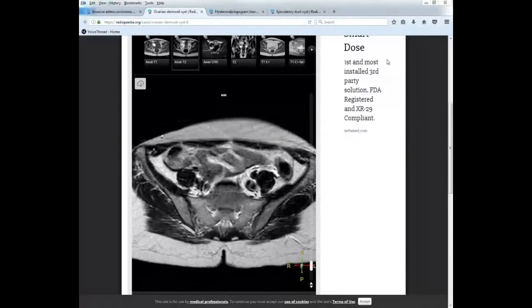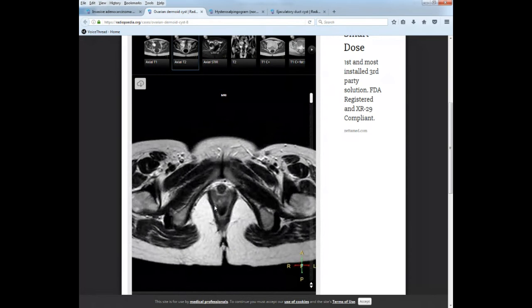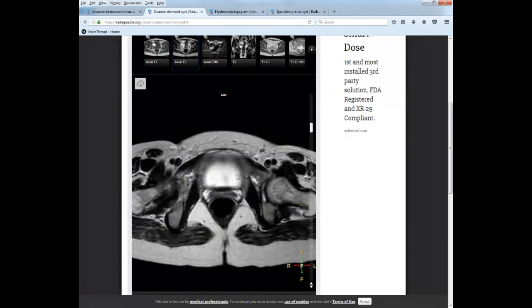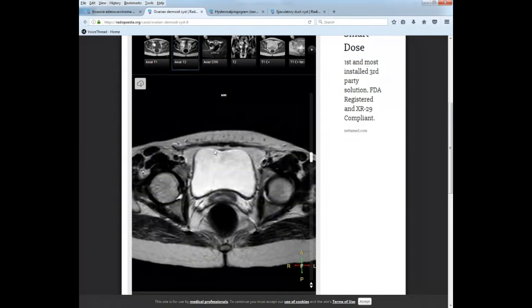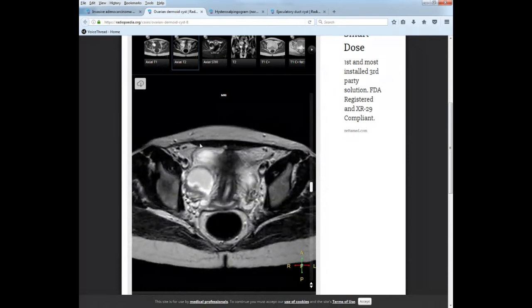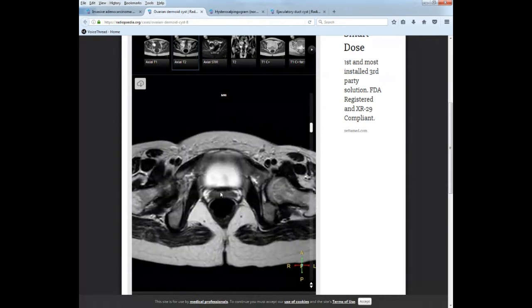We'll talk now about the female reproductive anatomy, and I'll go over some other anatomy that we haven't touched on, specifically the pelvic viscera. So real quickly, bladder. In most patients, it's going to pop right out at you. This is a pretty good sized bladder filled with some urine, and here's the rectum posterior to that. Whether it's male or female, you're going to have bladder anterior and rectum posterior. The only difference is there's some other stuff mixed in here, whether it's a male or female patient. And we talked about that in lecture.